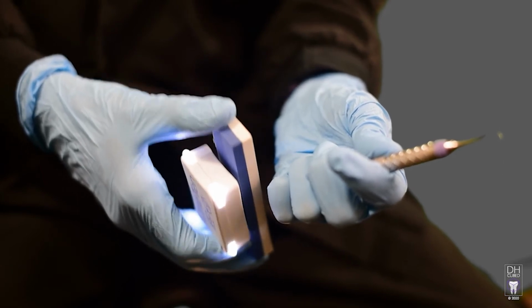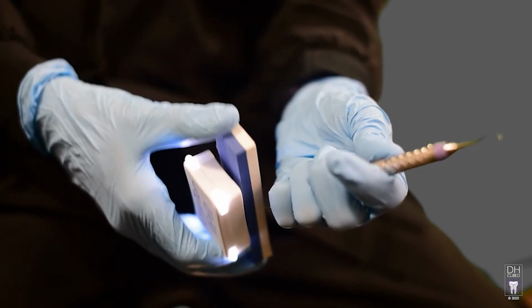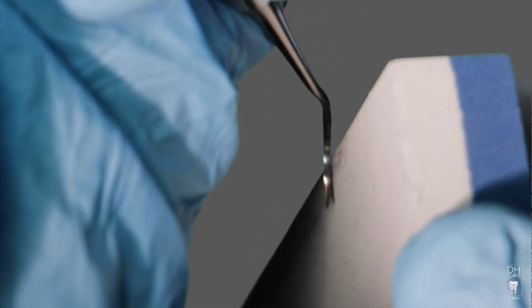If the end of the tip is sharpened, it will cause the instrument to become short and blunted, and again, too short to reach the interproximal well enough. Sharpen only 2 to 3 millimeters of the blade at one time. When doing this correctly, you will see a gap between the stone and the sickle at the tip end of the instrument. Begin to sharpen the first 2 to 3 millimeters of the blade at the terminal shank end of the instrument. Be sure to keep the face of the blade parallel to the floor throughout the entire sharpening process.